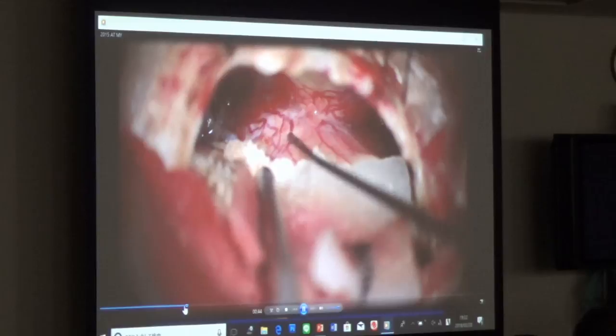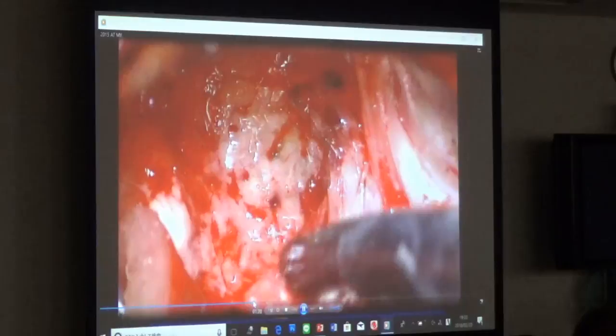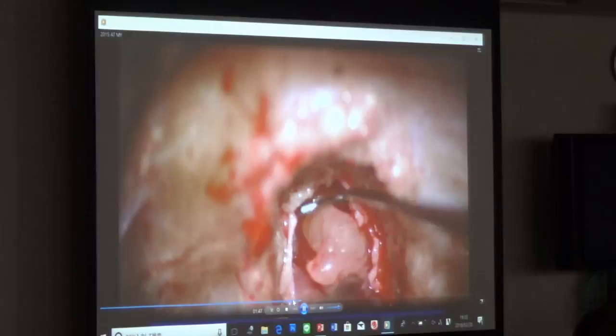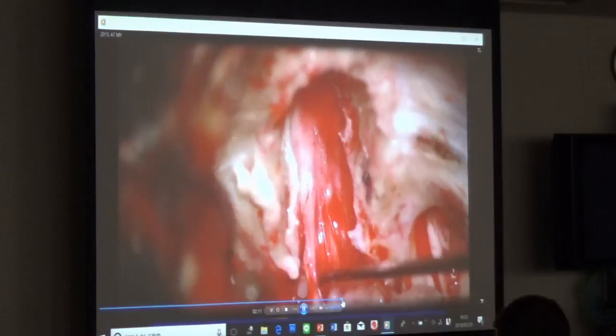And so there I open the posterior wall of the internal auditory canal like this, using a Sonopet, and then internal debulking using a CUSA as much as possible. Then I go back to the internal auditory canal. Sometimes I use a facial nerve stimulator. This Medtronic is very useful to elevate a tumor like this. And I have the CP Young micro dissector.